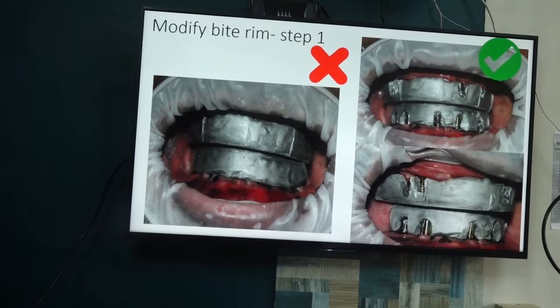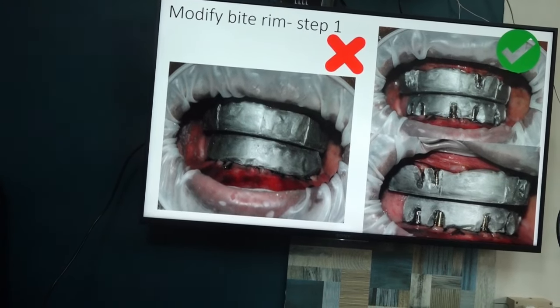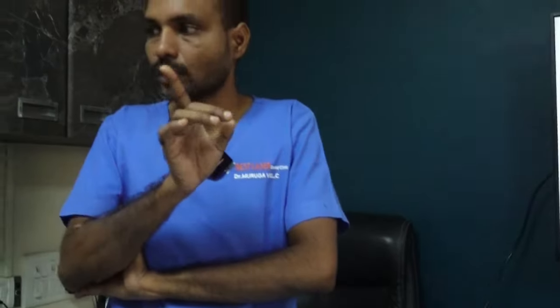Next. After you finish the canine line, midline marking, VD, jaw relation, and everything is approved, then you have to do an important step called modifying the bite rim. This is a very crucial step. If you don't do this, then you will be stuck in this step infinitely. You cannot finish the further steps.